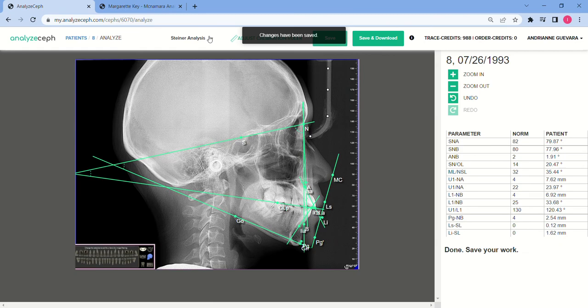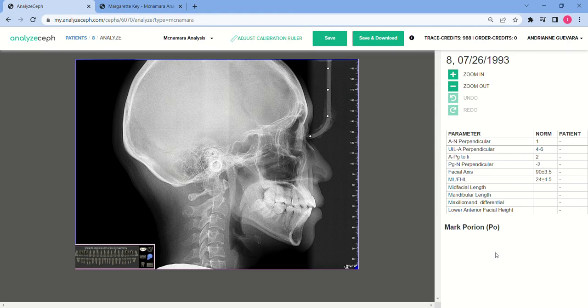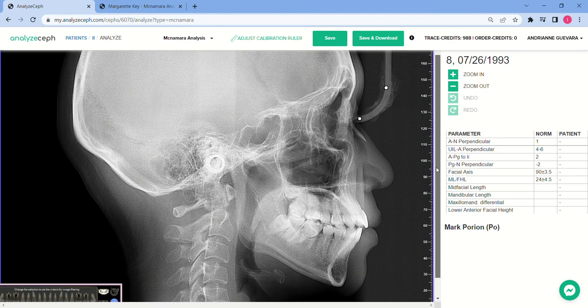Here on the drop-down menu is a list of analyses available for Analyzef. Today we're doing McNamara. On the lower right portion of your screen are the points that you need to plot for the analysis.